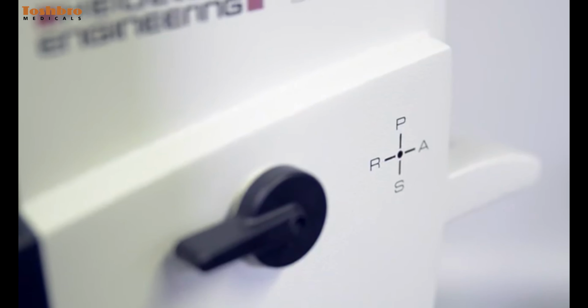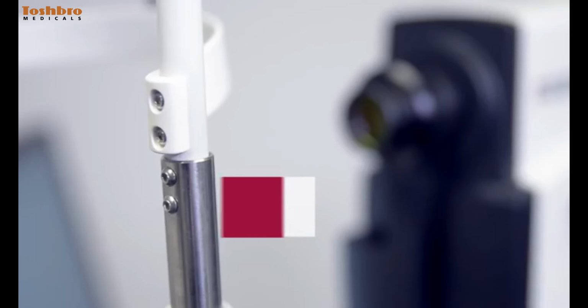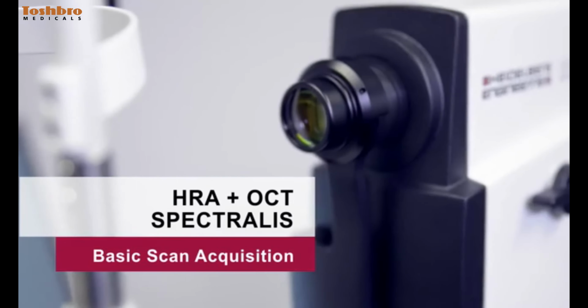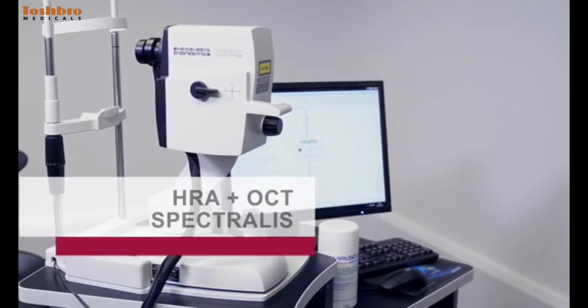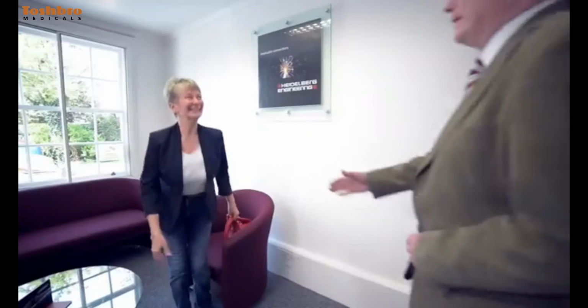This is a short instructional video for Spectralis users on how to acquire macular and retinal nerve fiber layer scans. This will comprise the use of line, volume and circumferential scans, automatic real-time and live eye tracking.